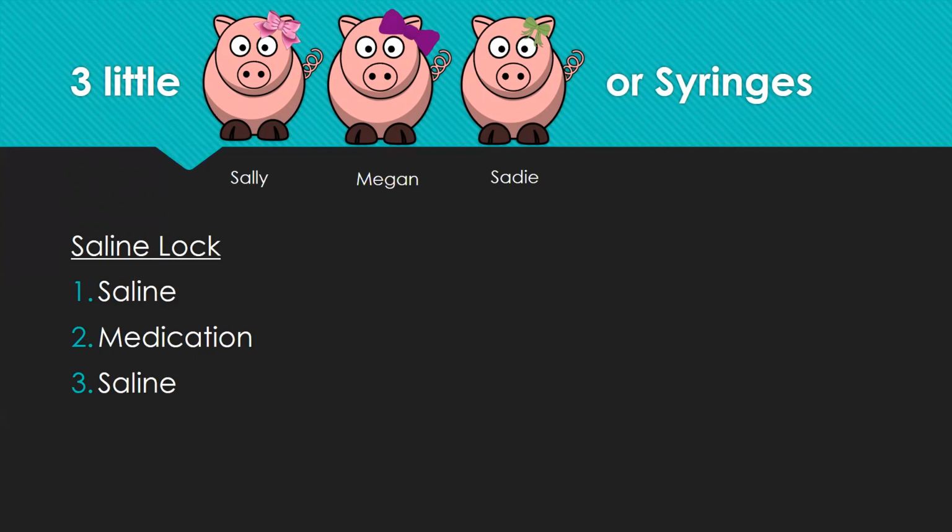second saline. So we follow with saline at the same rate the medication was given, because there's still medication in that J loop. And if we just push that second saline into the line without doing it at the same rate as the medication, we'll be giving the rest of that medication faster than the recommendation. So this could actually end up in reactions or side effects causing harm to our patient. And we don't want any harm to the surrounding tissue or to the patient in any form.